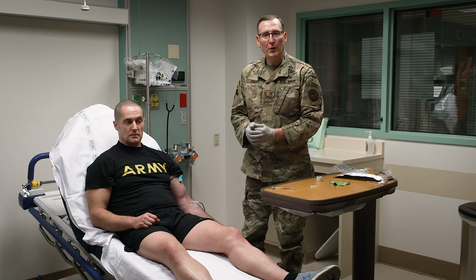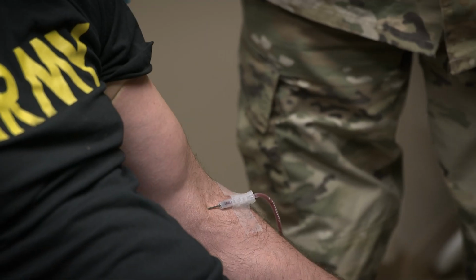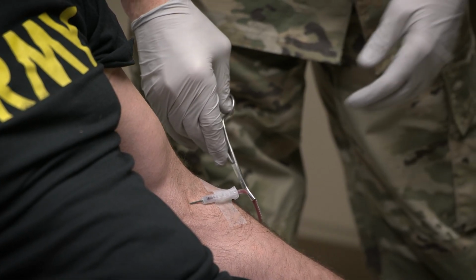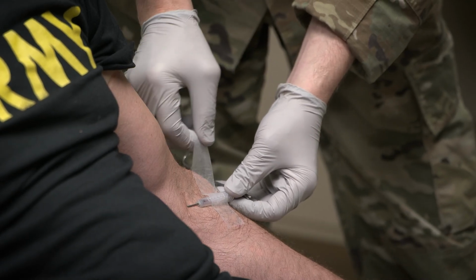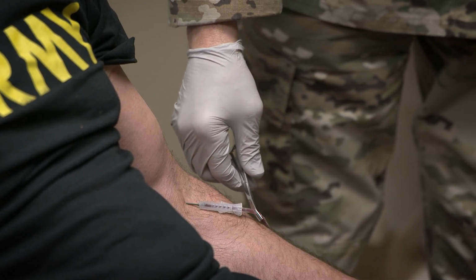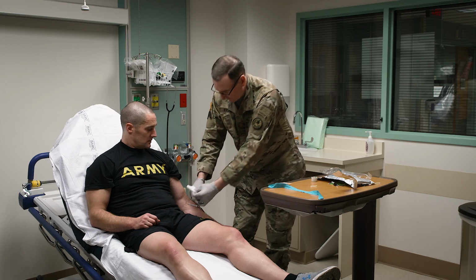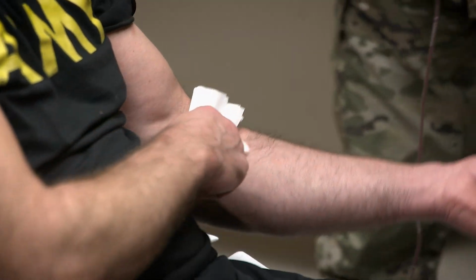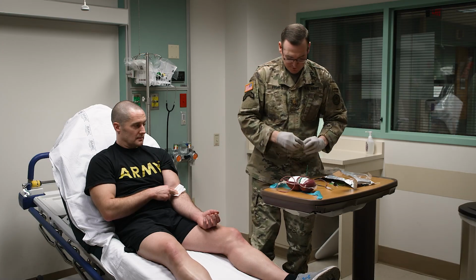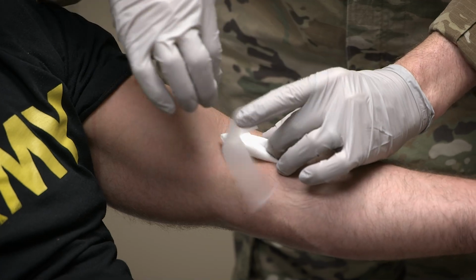So I see we're full now, and we can go ahead and disconnect this from the patient. First thing we're going to do is undo our constricting band. Next thing we're going to do is take the hemostat and place it over. I'm going to remove the tape, and I'm going to then place a 4x4 over the top of the needle and simply remove it. And your donor should be able to hold that in place. You can just place another piece of tape just like you would for any other IV or blood draw over the site.